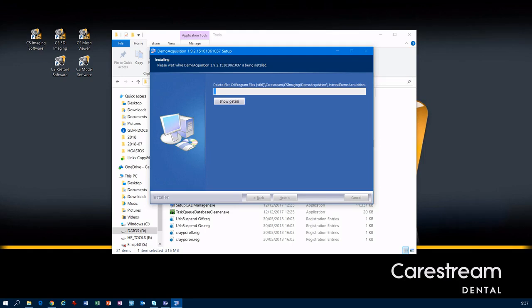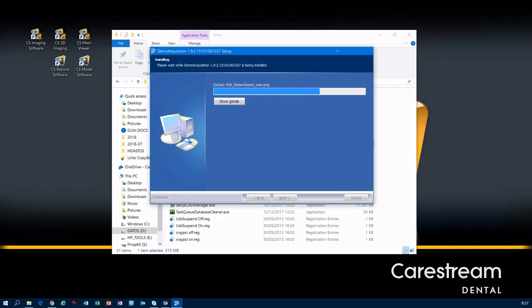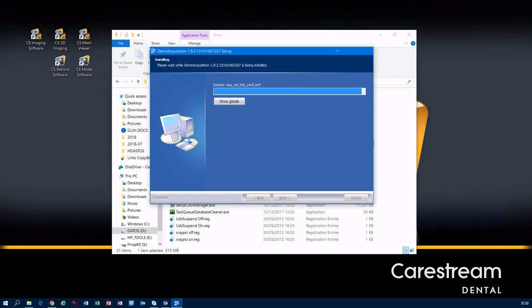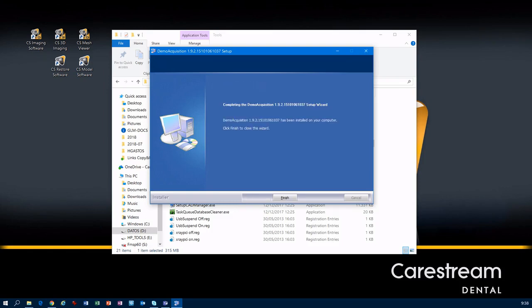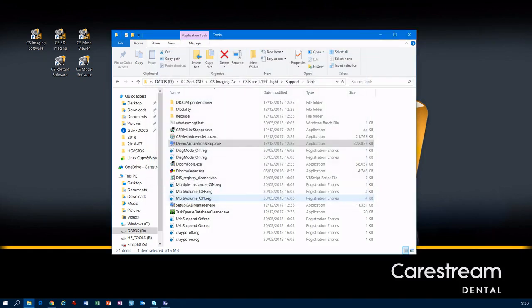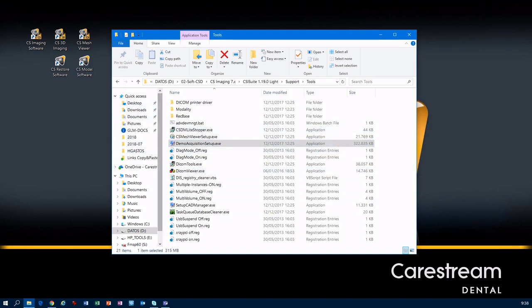It will take no longer than a couple of minutes. Okay, it's done, so now we can go to our C drive.